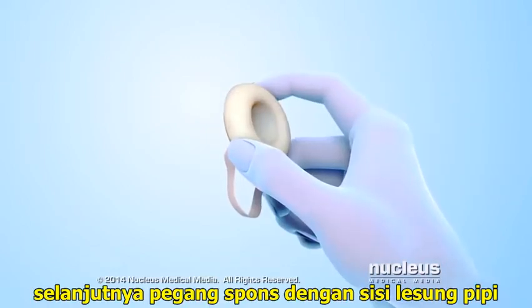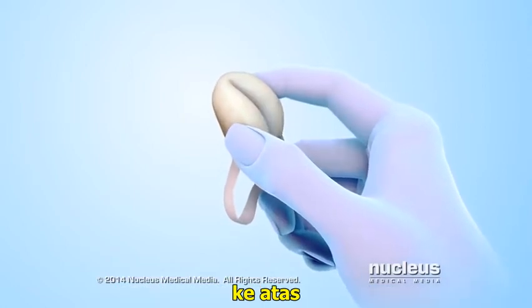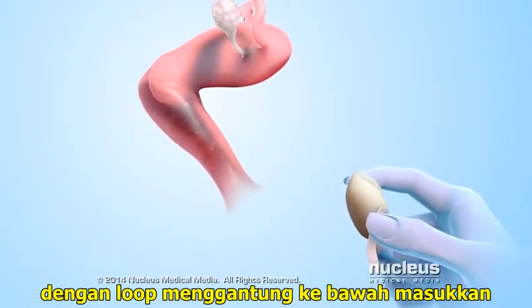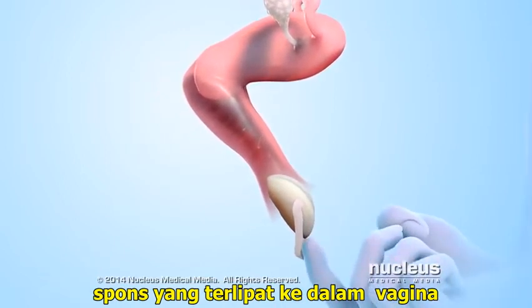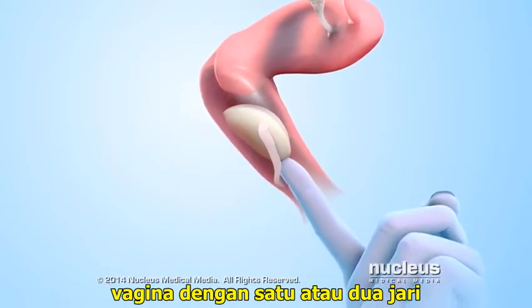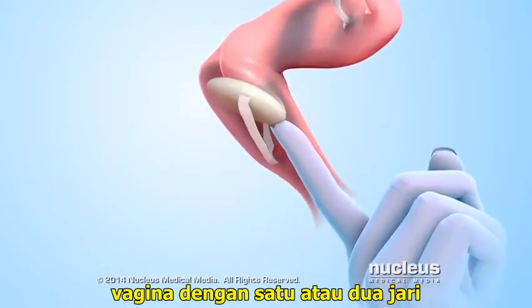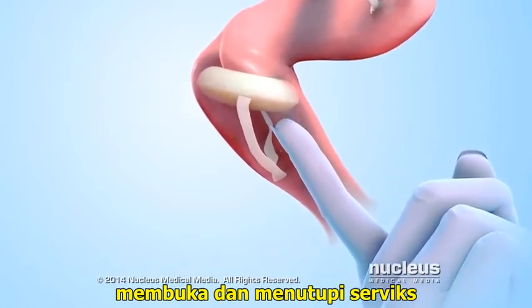Next, hold the sponge with the dimple side facing up and fold the sponge upward. With the loop hanging down, insert the folded sponge into the vagina. Push the sponge as far into the vagina as it will go with 1 or 2 fingers. When the sponge is released, it will unfold and cover the cervix.